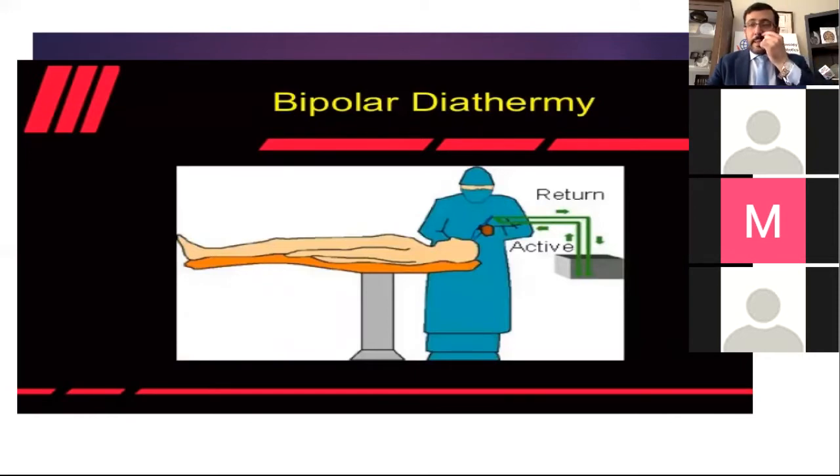That is also again a great innovation. This technique is very helpful, and we can use it especially in gynae patients. Personally, I will share my experience. Just yesterday I did a lap coli. That was a very difficult case, because about 2 months ago they did a cholecystostomy in another center. In such a case we wait at least 3 months, then adhesions will be less. But unfortunately the patient came back with acute cholecystitis and it was an urgent case.